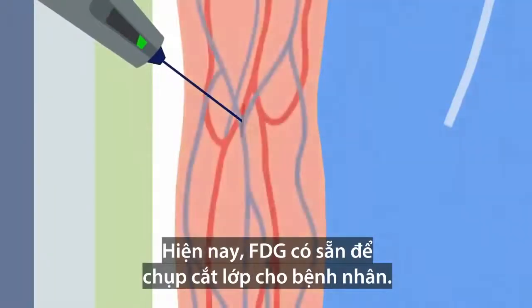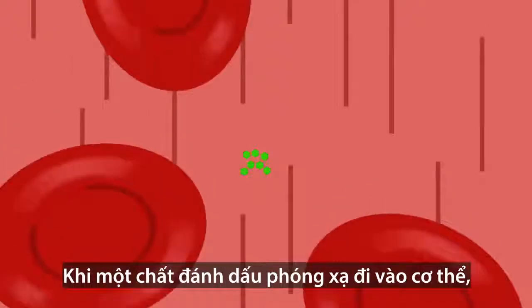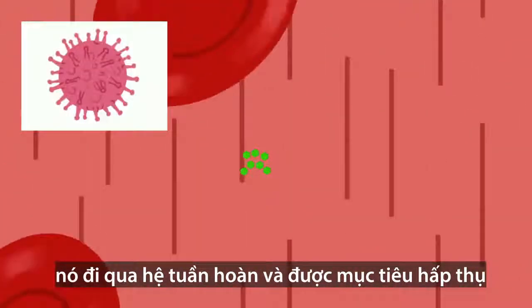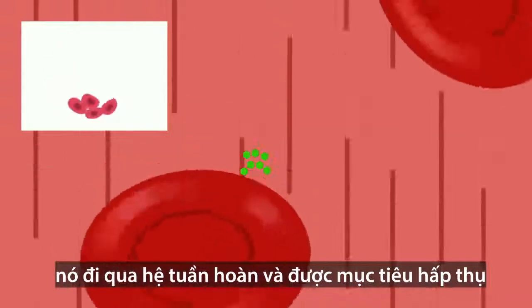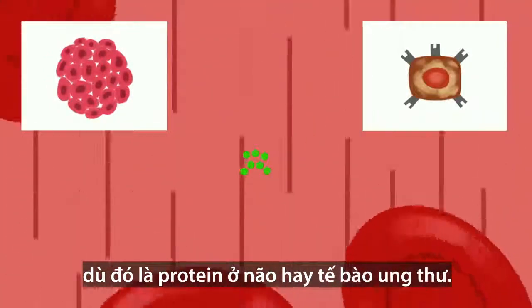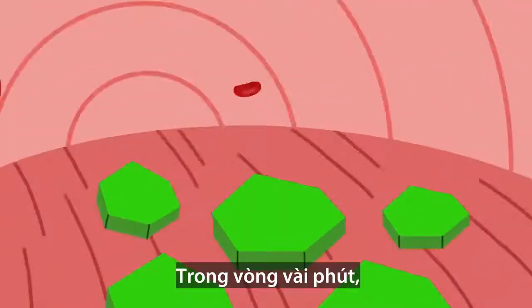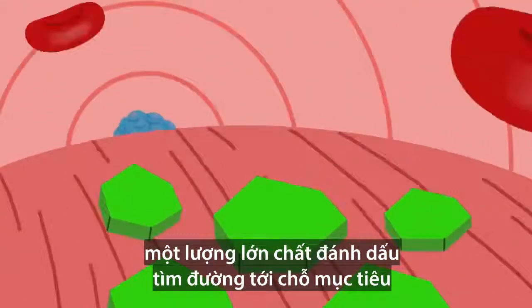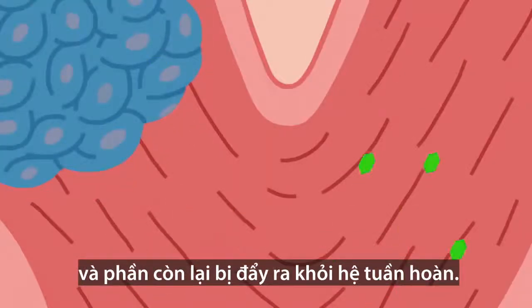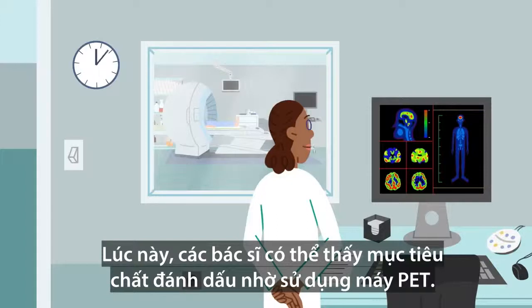The FDG is now ready for the patient's scan. When a radio-labeled tracer enters the body, it travels through the circulatory system and gets taken up by its target, whether that's a protein in the brain, cancer cells, or otherwise. Within a few minutes, a significant amount of the tracer has found its way to the target area, and the rest has cleared from circulation.